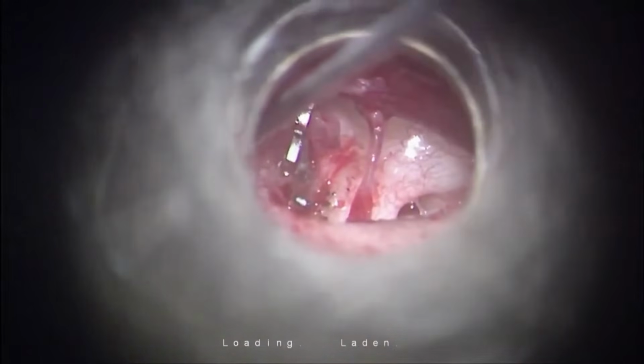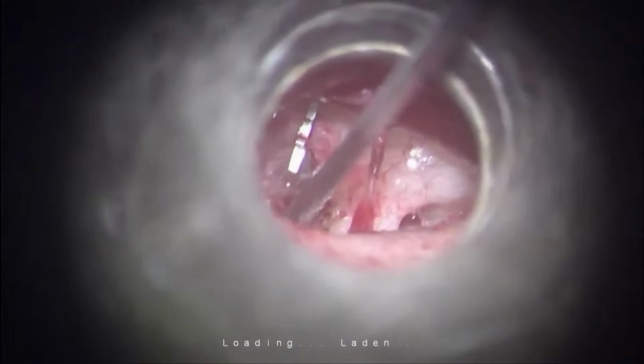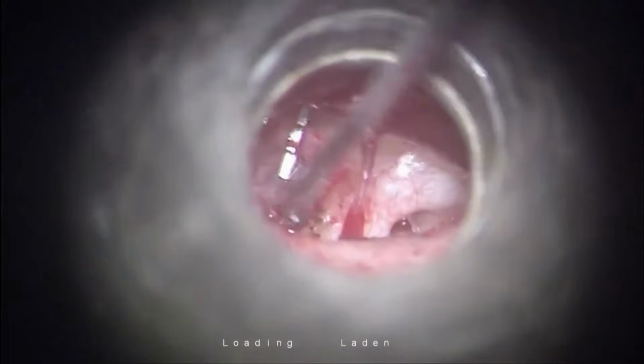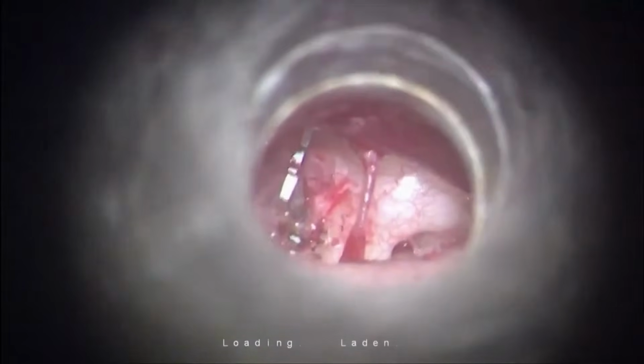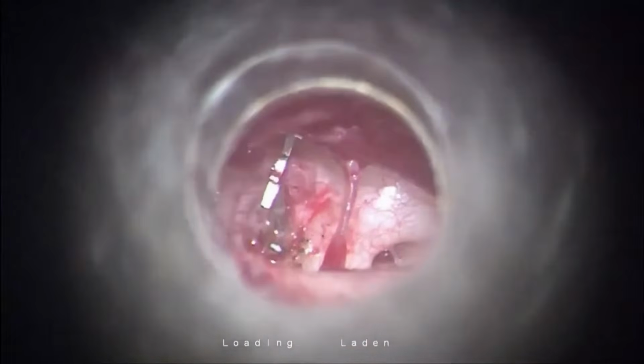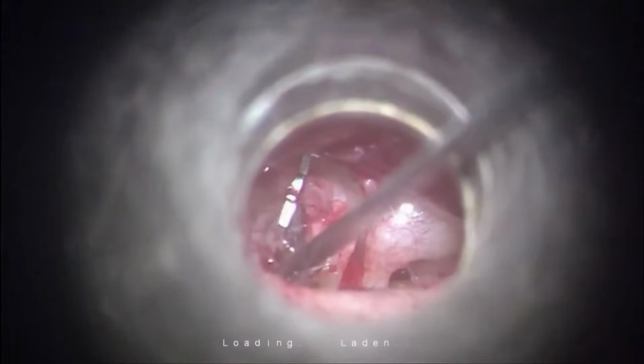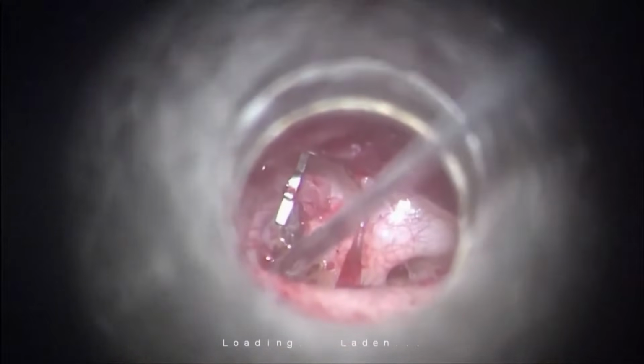Can you see? Yes. In the last case we saw a difficult situation of a thick footplate, which Ashish simplified by means of his wonderful technique of drilling, his expertise. This is a simple situation which is made further simple by the laser.